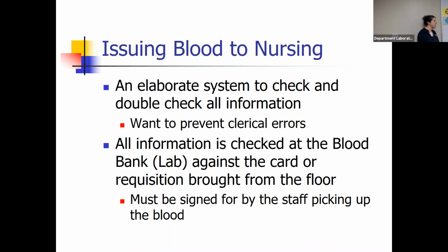Okay. We don't just cross match these units and then send them up. We don't know, and maybe that patient's not in their room at that time. Right. So nursing staff has to let us know that they're ready because of that 30-minute time requirement. All right.